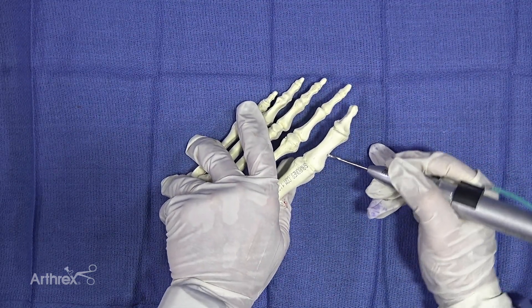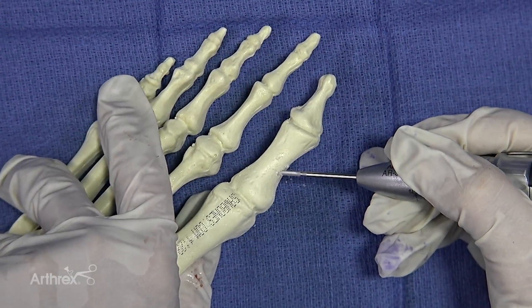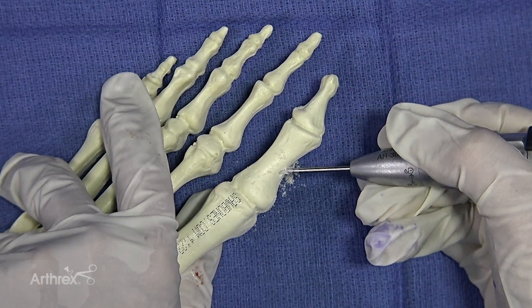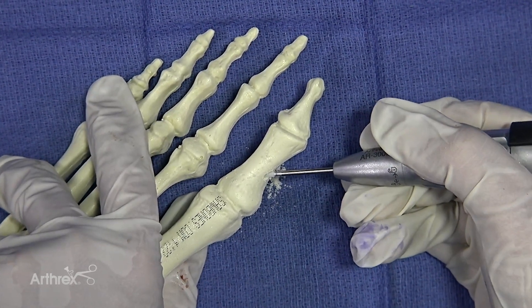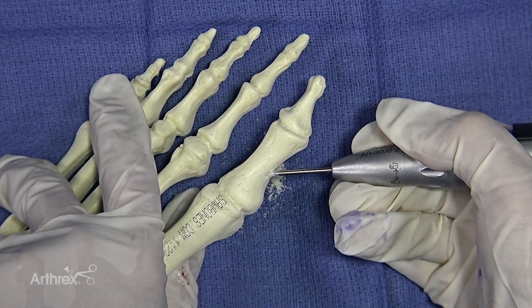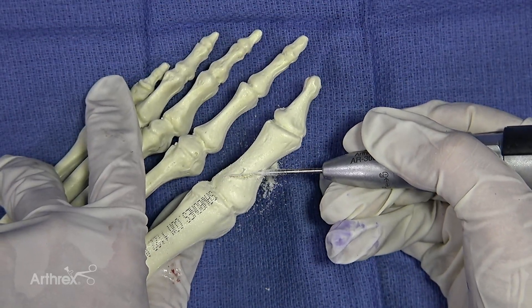Basically with the Aiken, you're going to start a little bit more distal and come in, and you want to leave sort of a little bit of a sleeve to greenstick it on the lateral side of the phalanx. Then you're going to pivot dorsally first and then you can pivot plantarly.